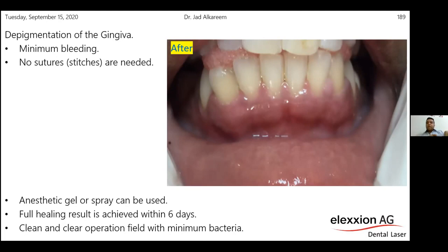So you apply the laser on it for up to 5 seconds, not continuously. You just apply the laser and go in and out until the end of the fiber is totally initiated. So that's the difference between initiated and non-initiated fiber.